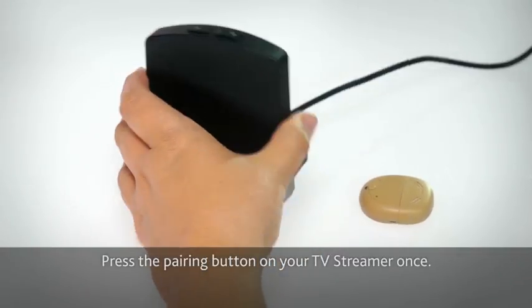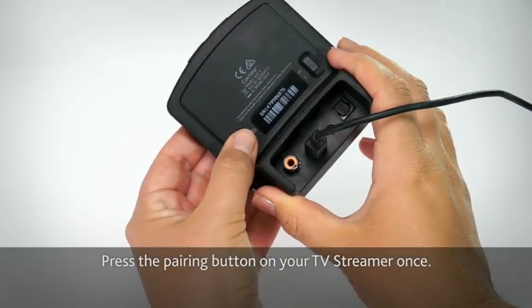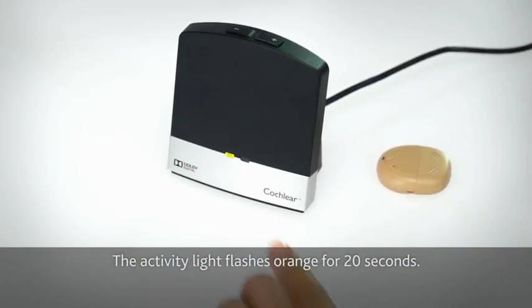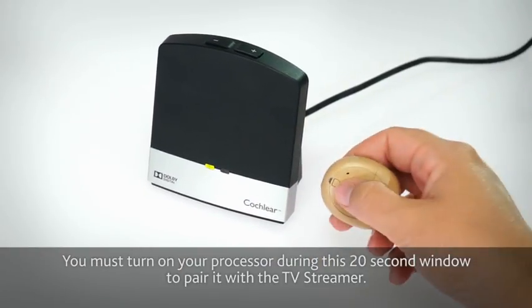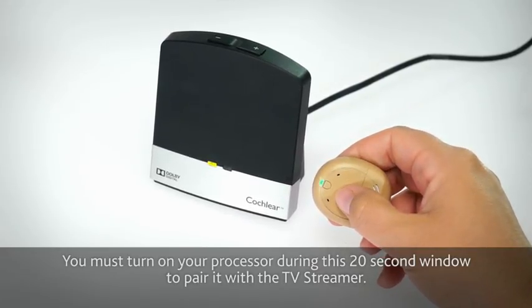Press the pairing button on your TV streamer once. The activity light flashes orange for 20 seconds. You must turn on your processor during this 20 second window to pair it with the TV streamer.